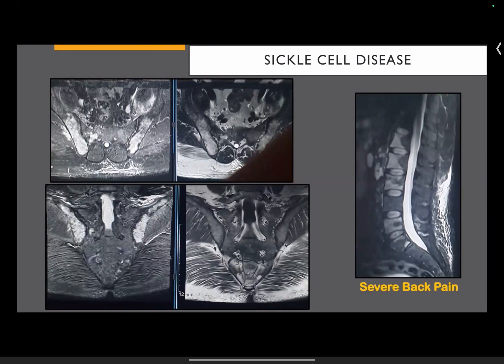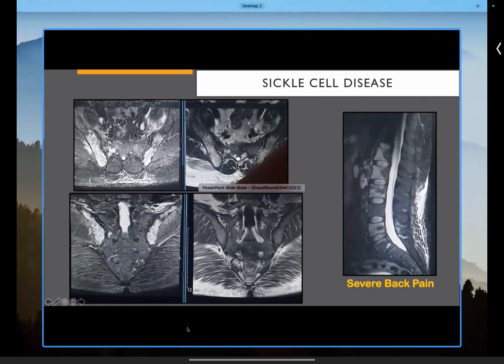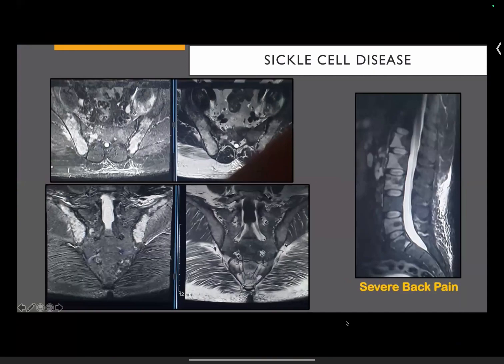I agree, sir. Does edema enhance on MR? If it's there around a lesion, sometimes it becomes difficult to differentiate where the margin of the lesion is and where the edema is. Well, edema can enhance, because it's just leaky capillaries. So it's important to have a pre-contrast image. In my experience, when I started, I didn't used to have a pre-contrast T1 fat-suppressed image, but now I tend to have at least one plain pre-contrast T1 fat-suppressed, just to have that idea. Then you can do subtraction as well to see if there's any enhancement.